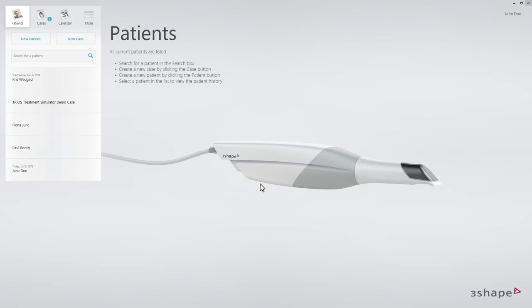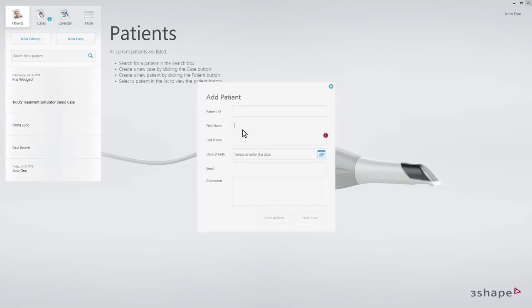This video will demonstrate the workflow for Trios Treatment Simulator in 3Shape Dental Desktop. Starting on the Patients page, fill in the patient name and the date of birth. Then click New Case.